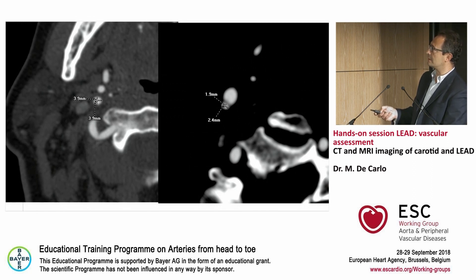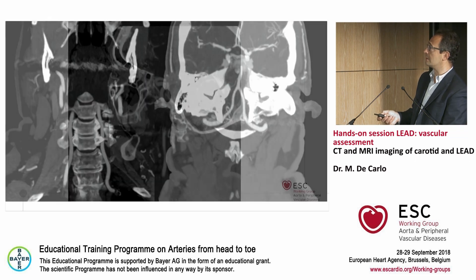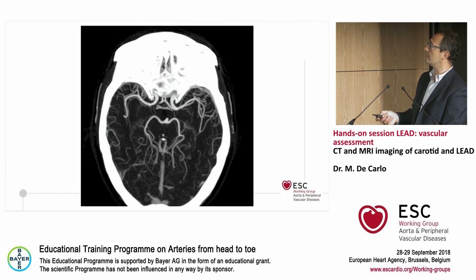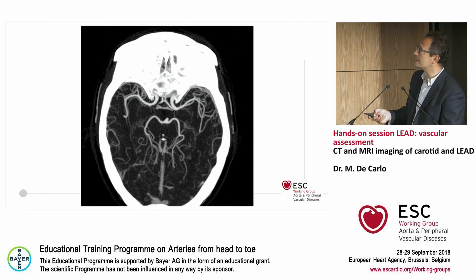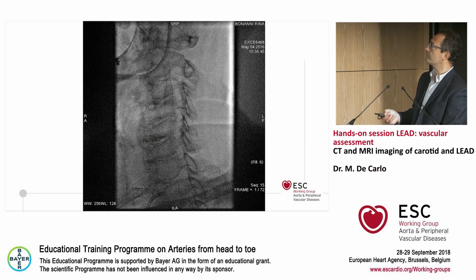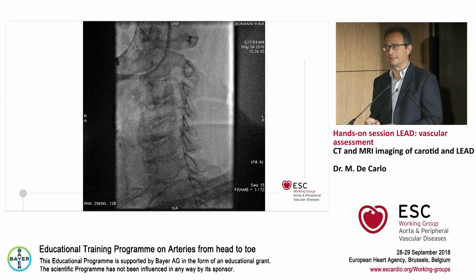This is the exact origin of the internal carotid: this is the external and this is the internal carotid — showing a tight focal stenosis. You can then have reconstruction of the posterior circulation with the vertebral arteries, basilar artery, and polygon of Willis. Here you see there is a hypoplastic communication between the anterior and posterior circulation. This patient underwent successful carotid stenting.